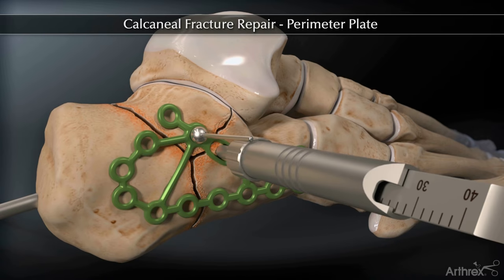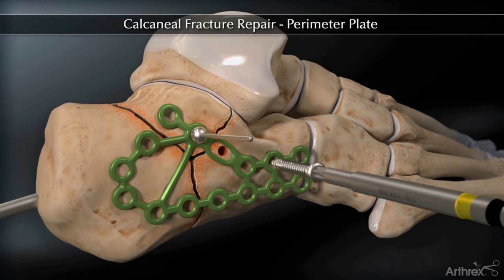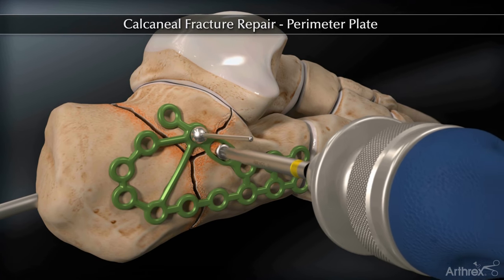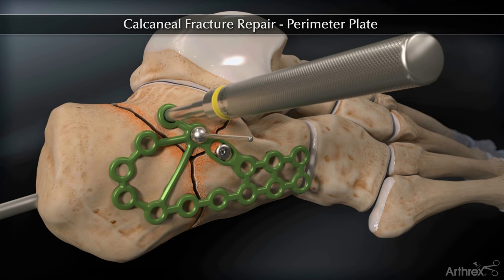Measure and insert a 3.5 mm non-locking screw. The plate may be contoured in situ using the bending guides or the locking drill guides.